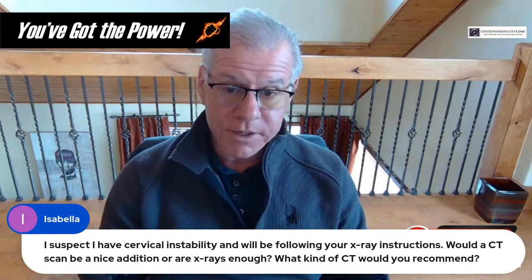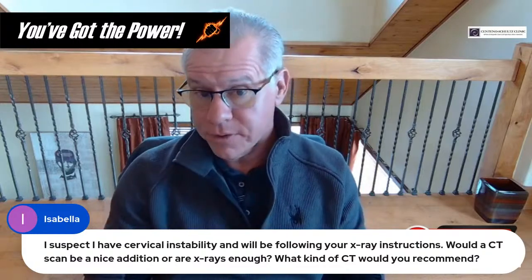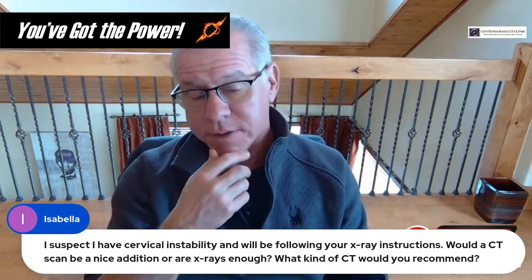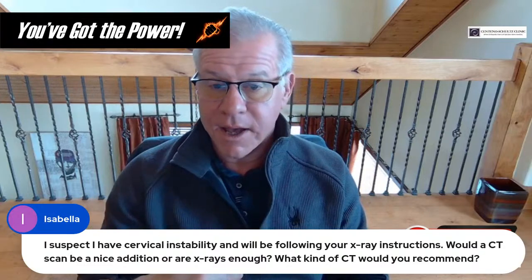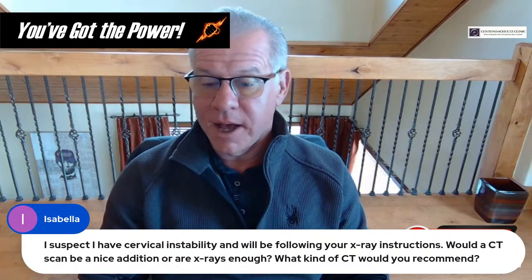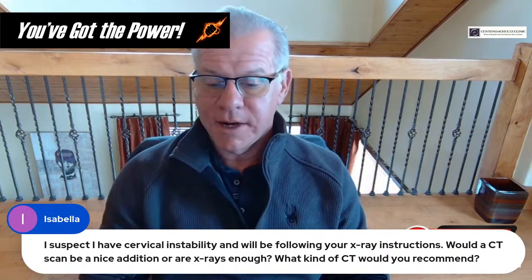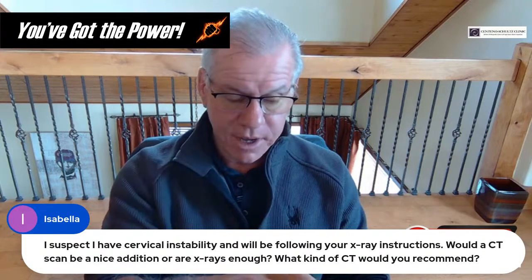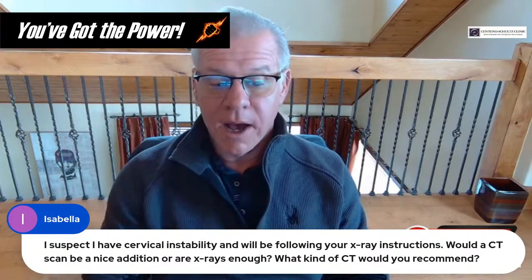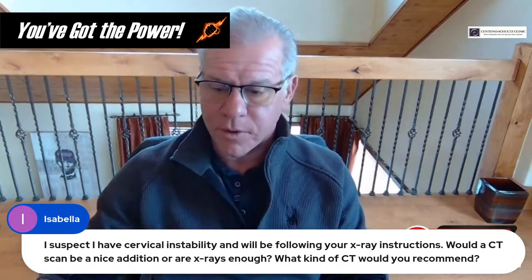You'd probably do much better to get a functional MRI and the open mouth lateral bending x-ray views, because you'll have very little x-ray exposure with the open mouth lateral bending views. And then you won't have any x-ray exposure if you're getting a functional MRI. So those are the two things I'd probably recommend. If only a CT is available, let us look first at the open mouth lateral bending views. And then if for some reason we can't get there just using those views, we can always get a CT. And that's going to be a CT with head rotation, following the 1987 paper by Jiří Dvorak, where he looked at normal versus abnormal for that.